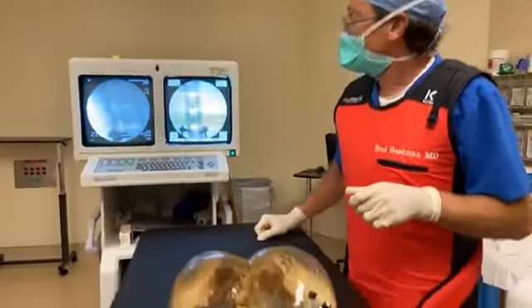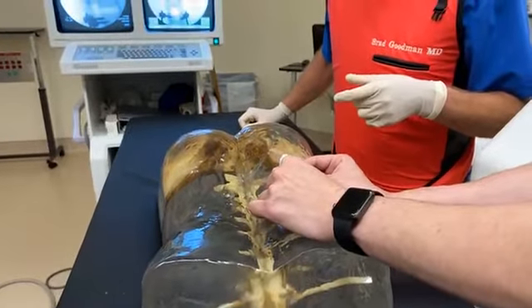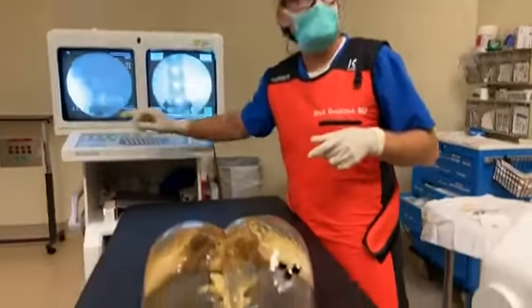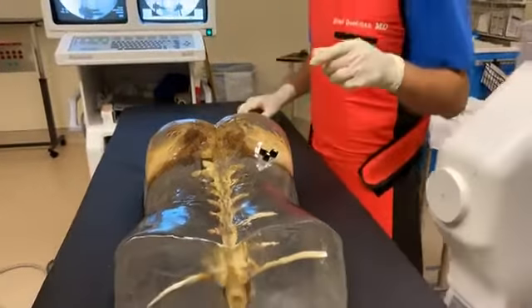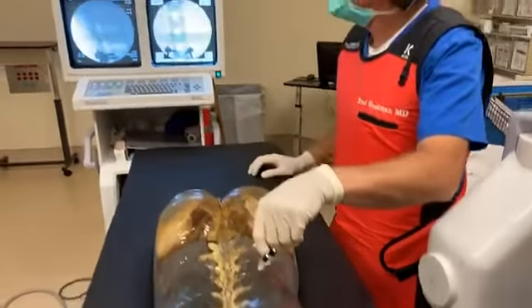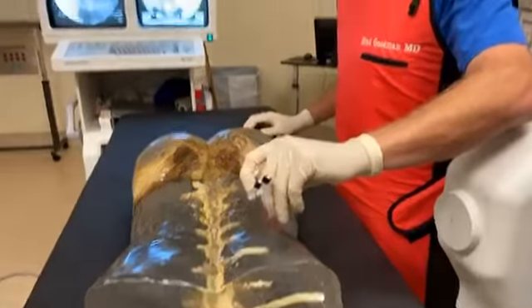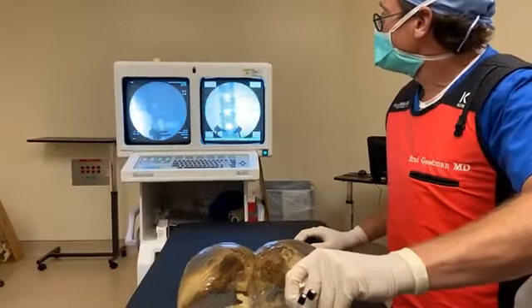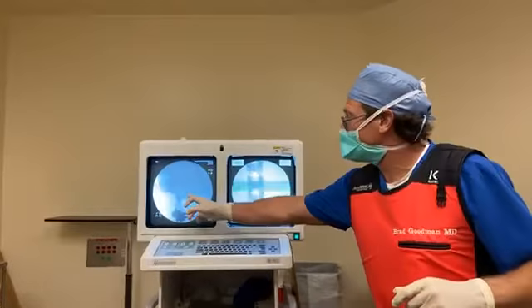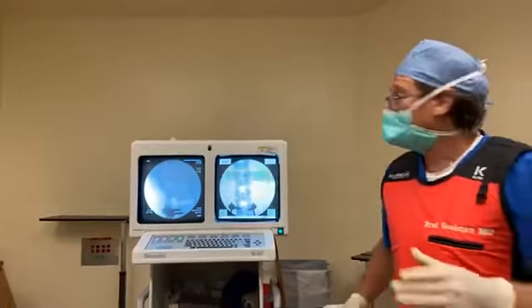Good. And now go down again. Docking notch to the head. Slide down. Perfect. Nice. And that's it. So you're in the back of the vertebral body. Okay. And we can go maybe a little deeper. Okay. So we're right up against the back of the vertebral body. That's super. Okay. So save that.